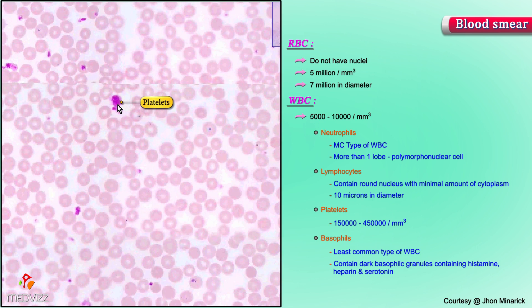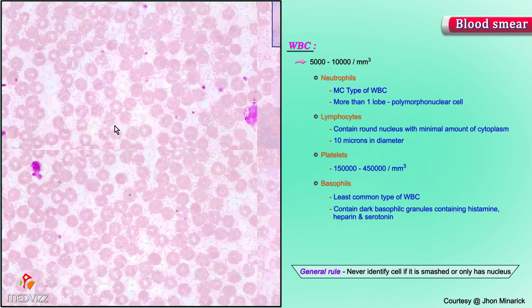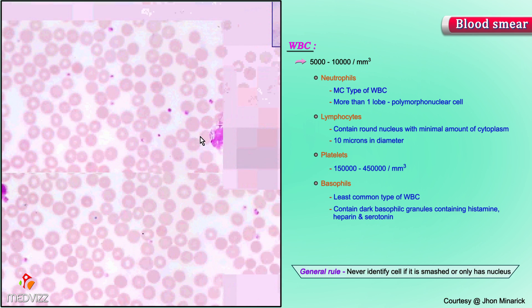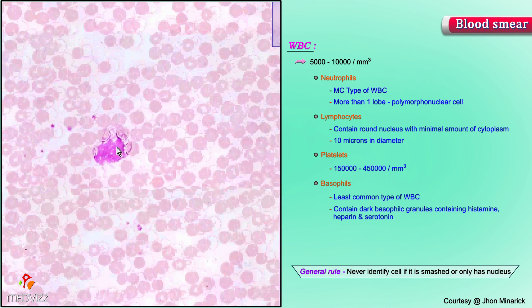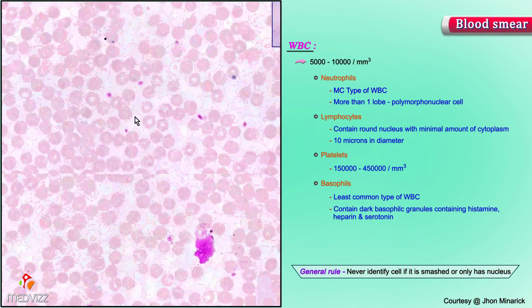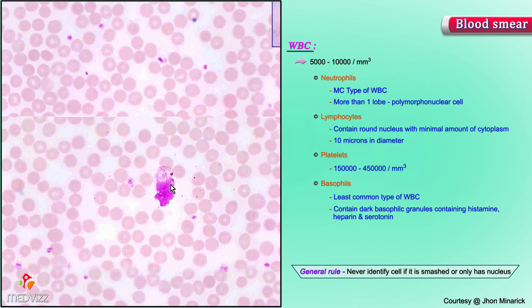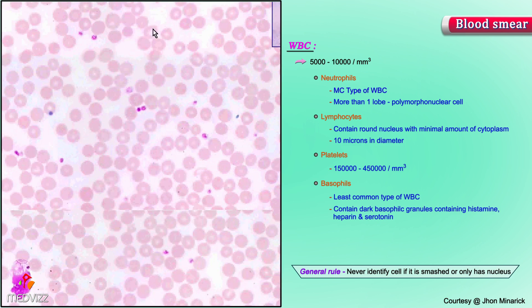Here is perhaps a large platelet or a fragment of a cell. The rule is never identify a cell if it is either smashed or smushed, or only has a nucleus — otherwise there's a good chance you'll be wrong. There's always a good number of cells on a smear that are smashed or smushed, and you don't want to try to guess what they are.